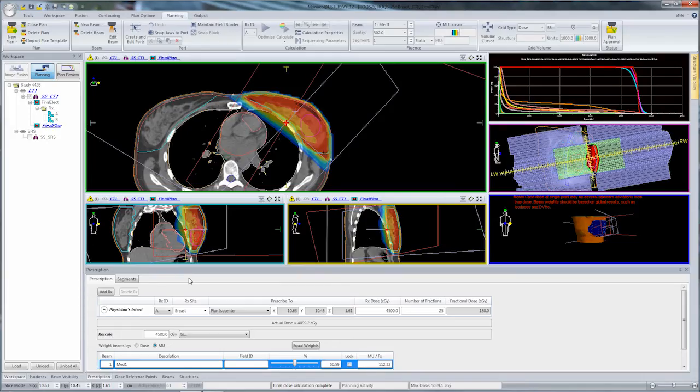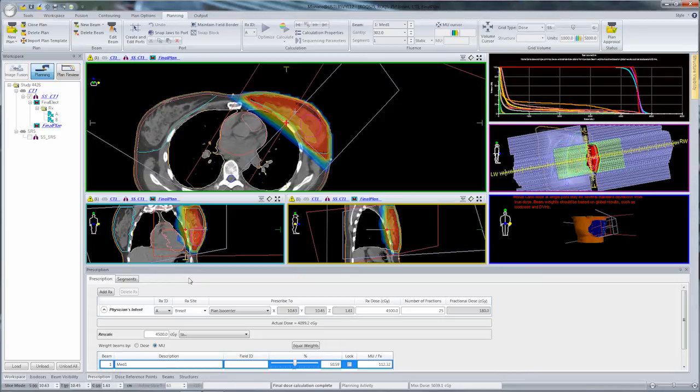In this particular case, I have a breast plan with tangent fields completed, calculated, and ready for treatment. But what we want to do is add an electron boost.